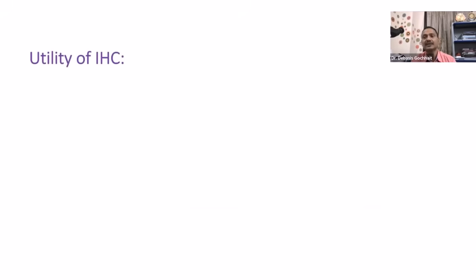Now, what is the utility of IHC? I have shown an example where it helps you to diagnose and confirm. First of all, it will help you to diagnose. If I am thinking whether it is a lymphoma, carcinoma, sarcoma, or melanoma, it will help me to confirm. Like I said, if cytokeratin is positive in the cytoplasm, you can say it is a carcinoma. Now categorize. I have told you again, categorize the type of tumor.